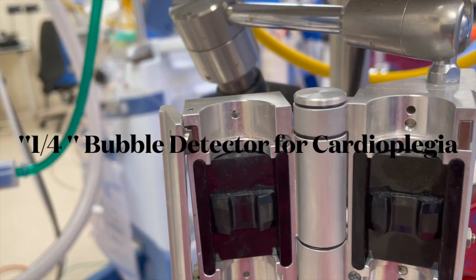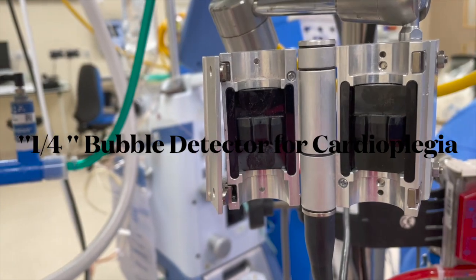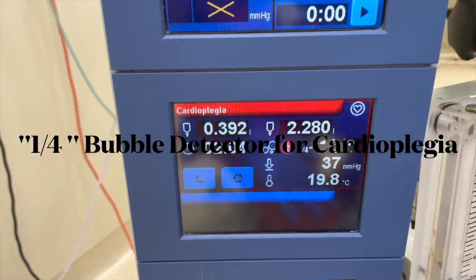Another location is on the cardioplegia line, which would stop air from entering into the cardioplegia system and reaching the heart directly. The ideal safety approach would be to have multiple bubble detectors.